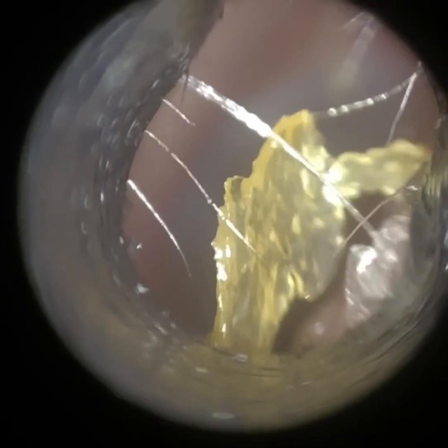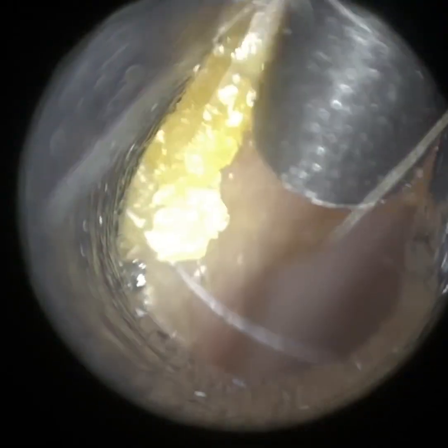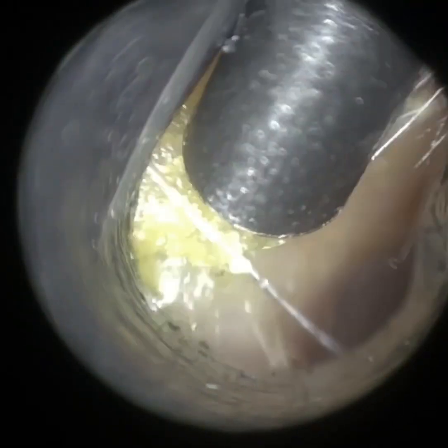So the ear canal's clear, just some dead skin just here at the entrance. You can see we just changed the focus to visualise that, and there's some on the posterior canal wall. Despite the narrowing, we're still able to visualise the eardrum. The Waxscope has great magnification, and we can of course adjust the focus easily to get a clear image of the eardrum, even if it is really deep in the distance.